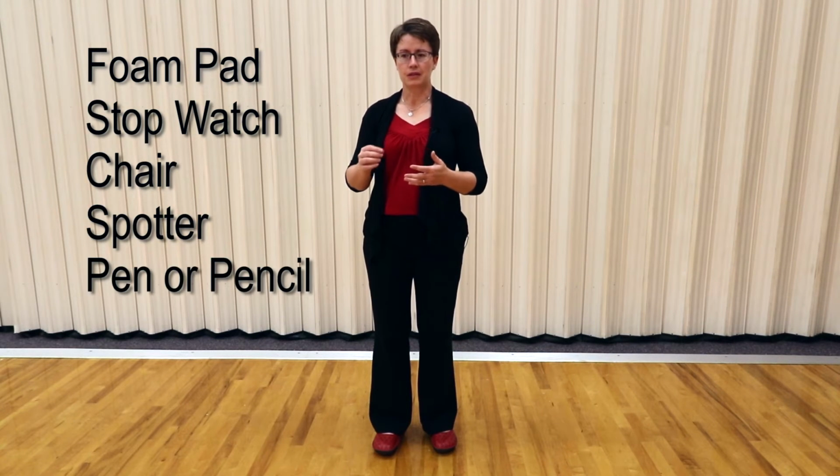Section 6 of the exam is the balance error scoring system, also known as the BESS test. For this, you will need your foam pad that is at least 16 by 16 inches, perhaps larger, a stopwatch, a chair, a spotter, and something to write with. Your person that you're assessing will need to be barefoot, no ankle tape, no ankle braces. Balance will be assessed in 3 stances, both on a firm surface and then on the padded surface.